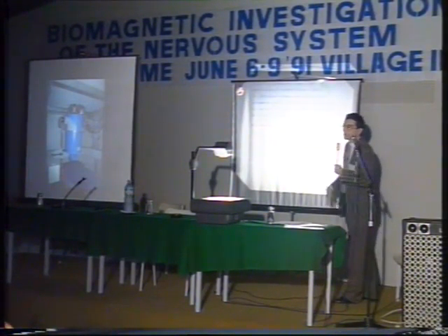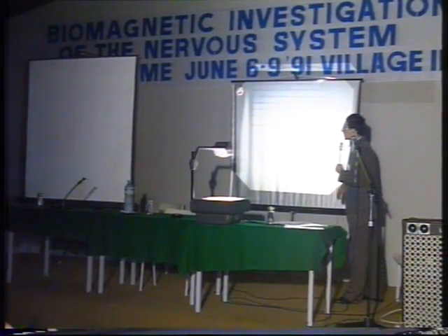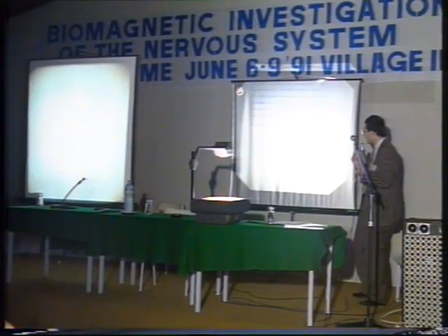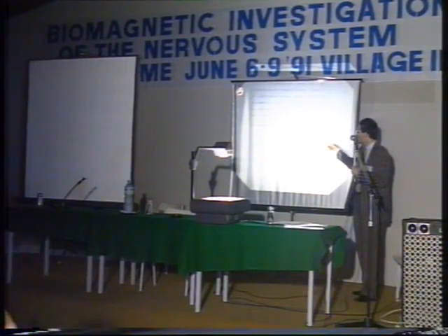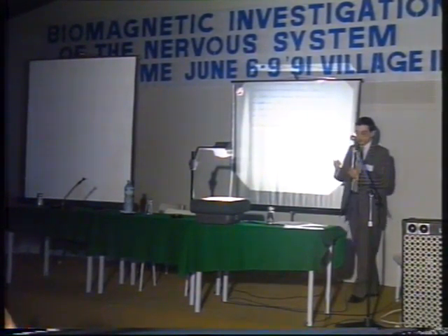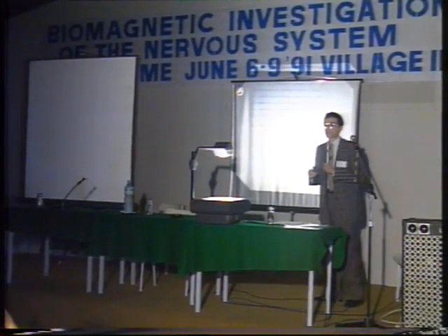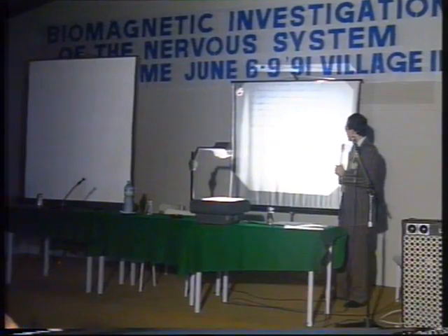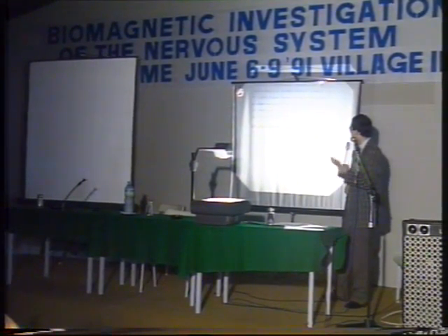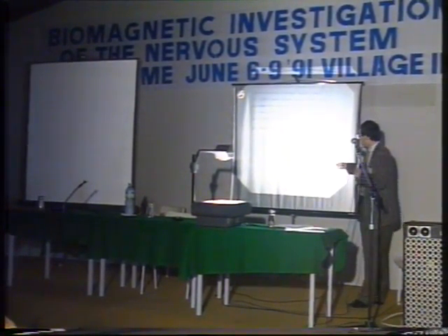Okay, so you can turn off the slides, just to show you the system. The stimulation of the median nerve was carried out just as Dr. Persons showed you before: electric stimulation at the wrist and recording done on the head.